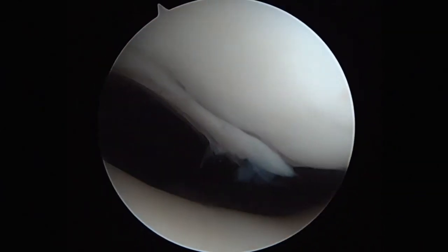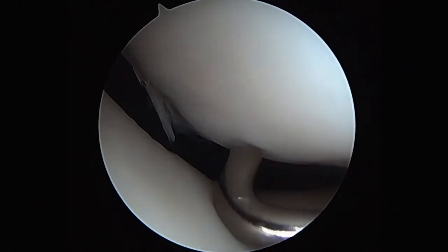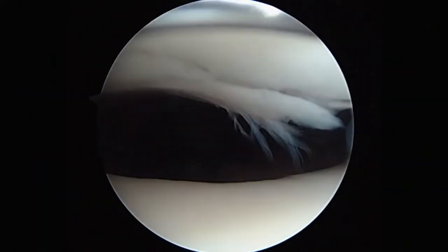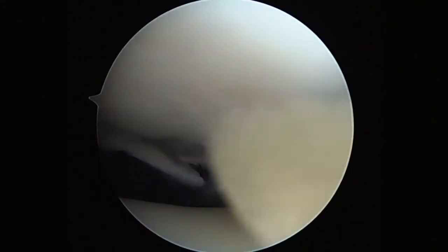Moving into the patellofemoral compartment, what we're seeing here is chondral delamination of the chondral surface. This is initially probed through the anteromedial portal, and the third portal is made through the supralateral region initially with a needle, followed by a blunt trocar.